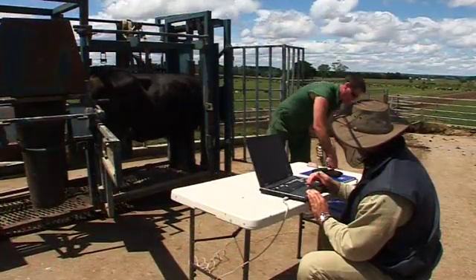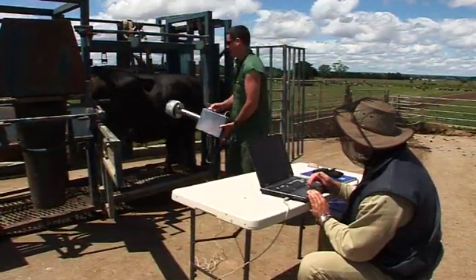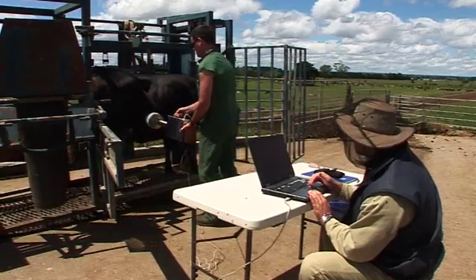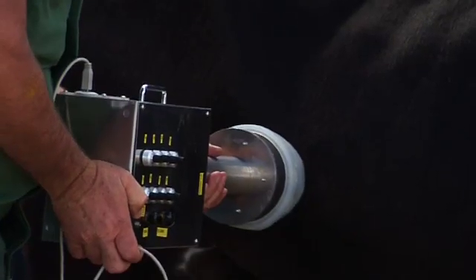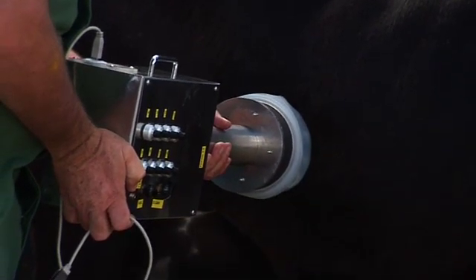The scanner has yet to be christened, at least with a name that the inventors are willing to say on camera. But you can be sure the birth of this new gizmo will take some of the labour pains out of preg testing for producers across the country.